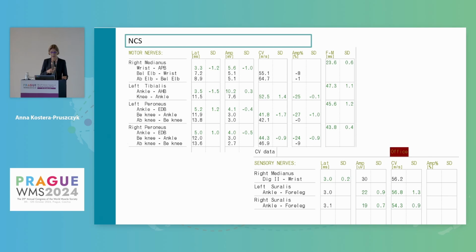In the nerve conduction studies, and the original EMG focused on the lower extremity nerves according to the symptomatology, there was really nothing. She had normal CMAP amplitude, distal latencies, and the conduction velocities were within normal limits. There were no F-wave abnormalities, and the sensory study was completely normal. Her CK was normal, and the needle EMG did not really show anything relevant.